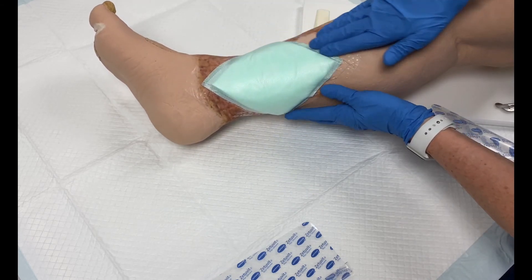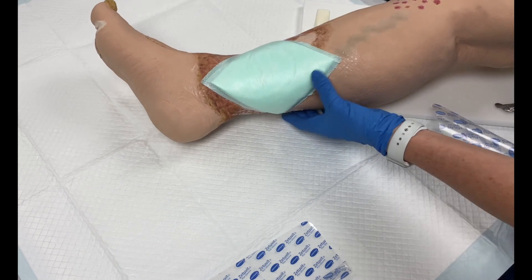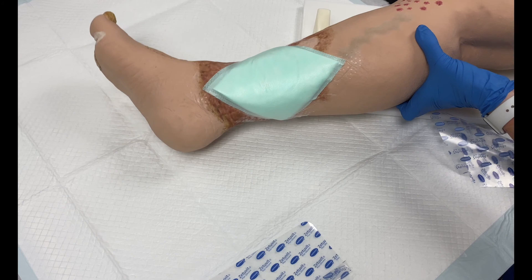When it's time to remove the dressing, you can slowly peel the dressing from the edge until it is fully off of the wound. The silicone gel on the Zetivit Plus silicone border dressing is designed to be gentle during removal.